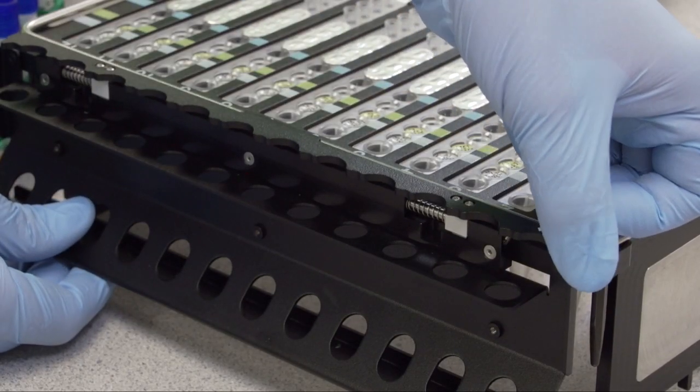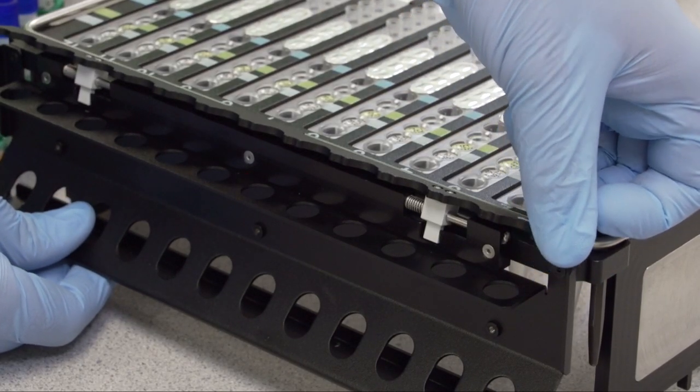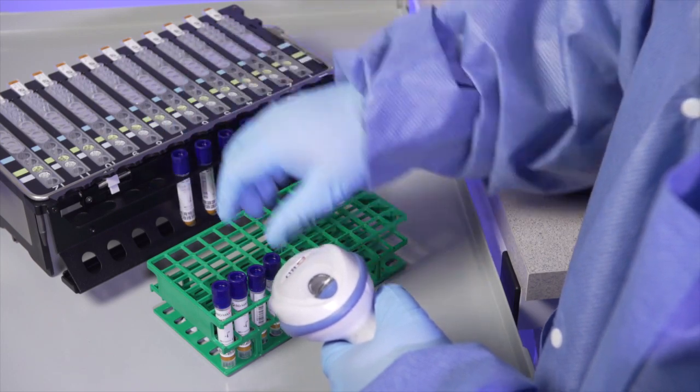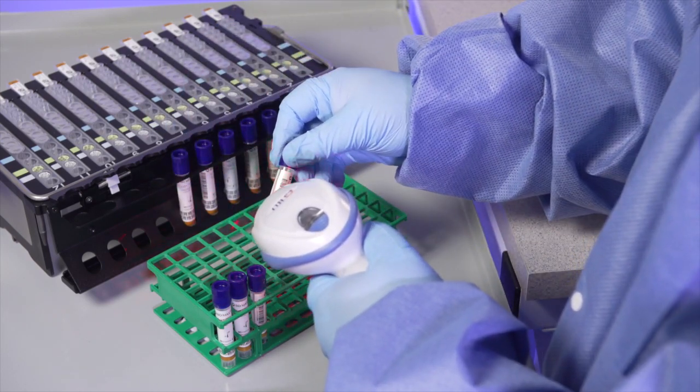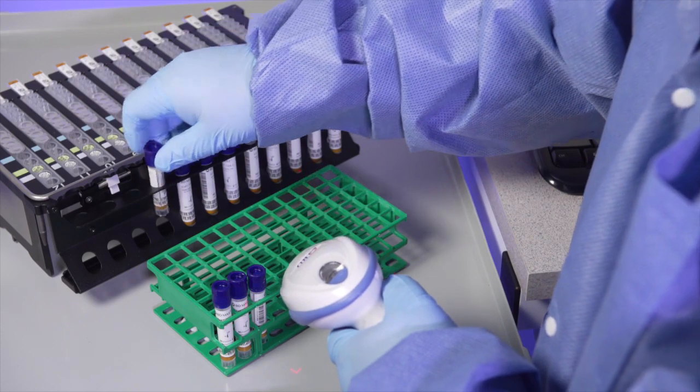Slide and rotate the latch mechanism open. Place the sample buffer tubes into the BDMAX System Rack corresponding to the unitized reagent strips previously assembled.